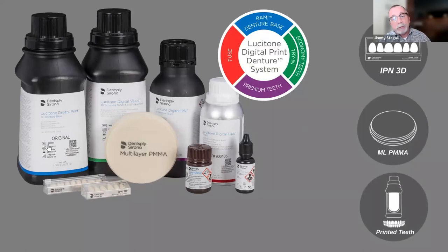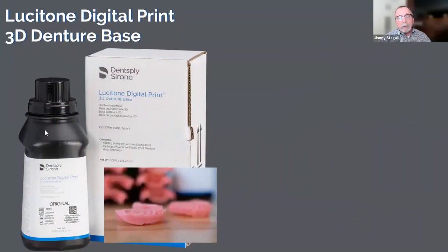Lucitone Digital Print is a full, FDA-cleared system start to finish. We have a one-liter bottle of base resin with a blue stripe, a one-liter bottle of value resin — usable as a monolithic try-in or validated as denture teeth — a half-liter bottle of Digital IPN premium resin for teeth, and three bottles of the Lucitone Digital Fuse system for bonding teeth to bases. We also have multi-layer PMMA validated as a tooth material, and carded teeth.